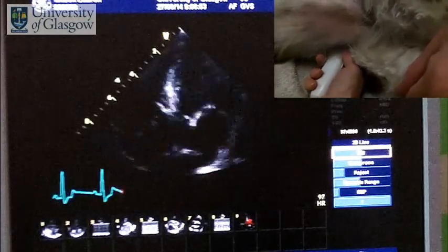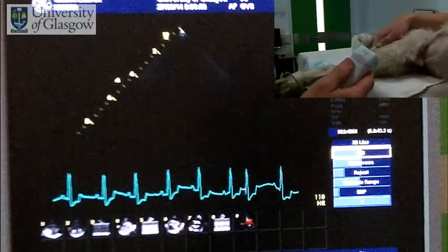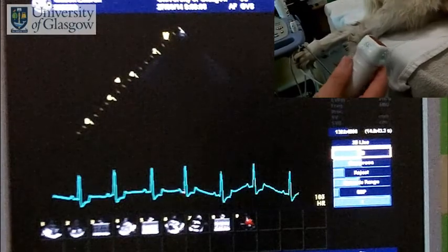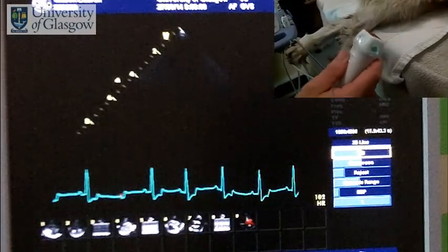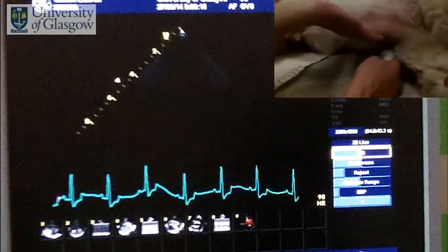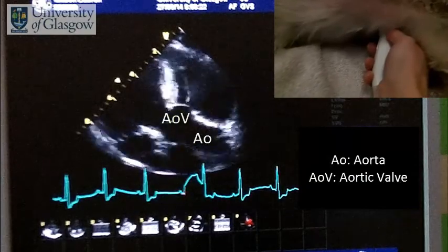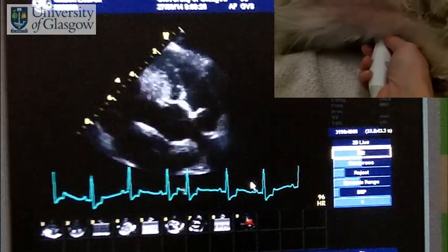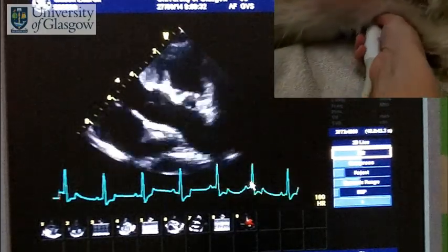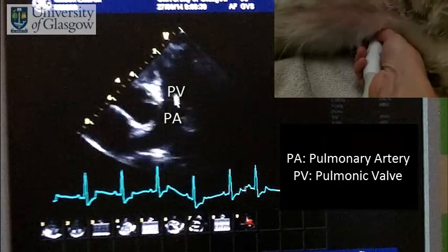The last thing we want to do is have another look to make sure the pulmonary artery is absolutely normal. To look at the pulmonary artery from the left we do a rotation through 90 degrees, placing the probe at the base of the heart, further forward from the apex. First of all we see a very nice image of the aorta and the aortic valve, and then by tilting the probe a little bit down we can see an image of the pulmonary artery — there's our pulmonic valve and this is the pulmonary artery.